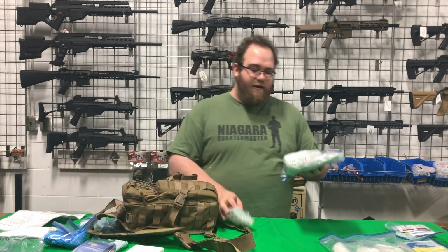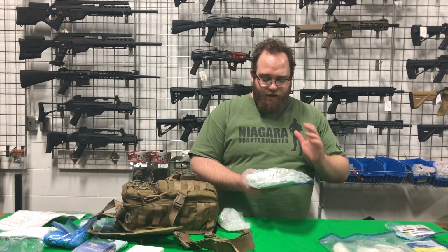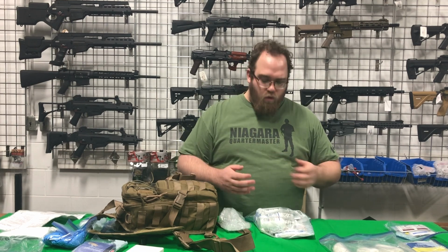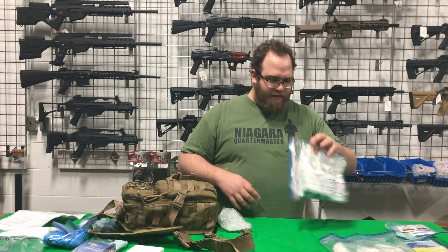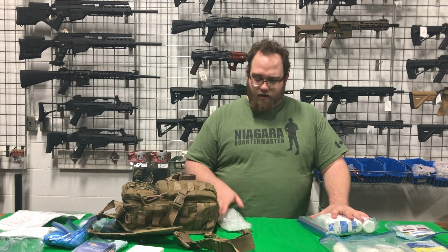So this is my major kit for major traumas: huge patches for wounds, bigger cuts, special bandages that actually lock into each other so I can actually close a wound, saline washes, rubbing alcohols, another clamp set. So that's a huge first aid kit. That one again is for major traumas.